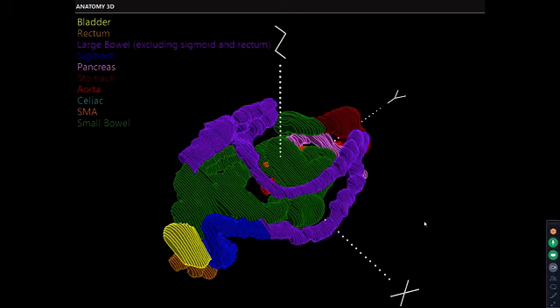And then more importantly, if I have great coverage, everything has its trade-offs. And so when I'm thinking about things like target volume coverage, I really want to make sure that everything from an organ at risk standpoint is accurate, because that is equally important when a radiation oncologist is assessing a plan. And I think if we don't pay enough attention to that, you could really end up with a plan that isn't what you think it is. Yeah, I really second that thought.